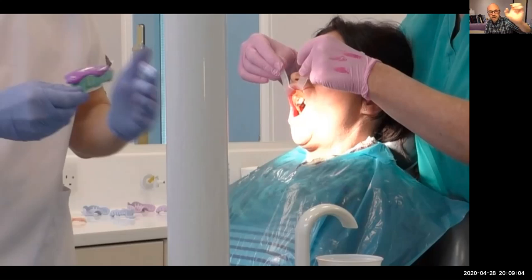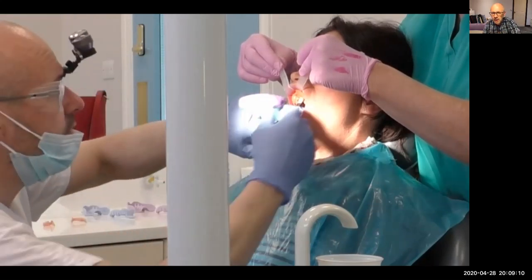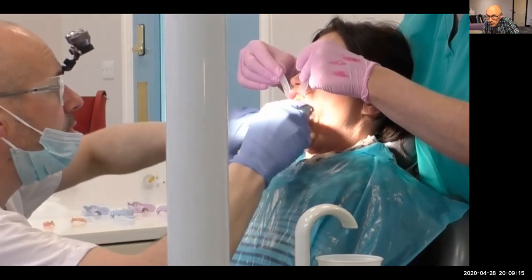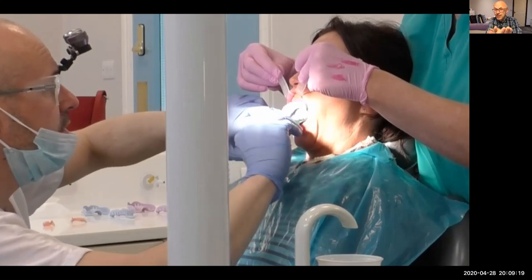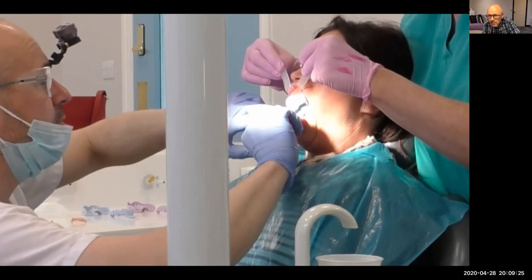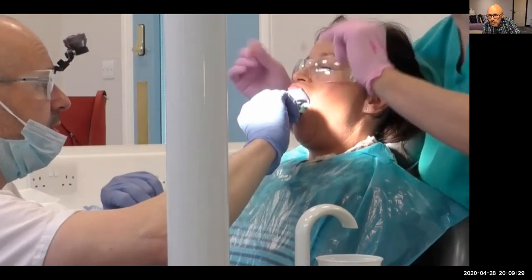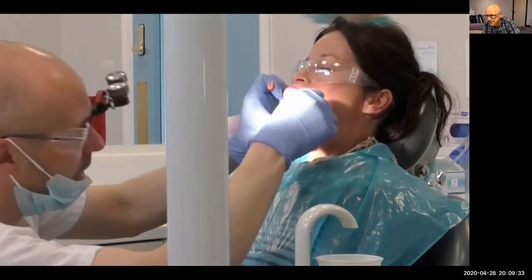I've got my base material prepared there, and I'm going to now put this into the mouth. I'm talking to Donna now. I'm just rotating the tray in. I'm going to seat it up at the back of your mouth first. You breathe deeply through your nose, Donna, nice and deeply. And then I push that up at the front. Claire, just lift those retractors out of the way.